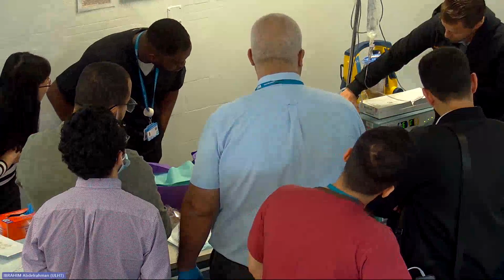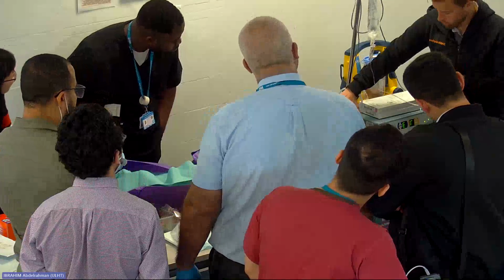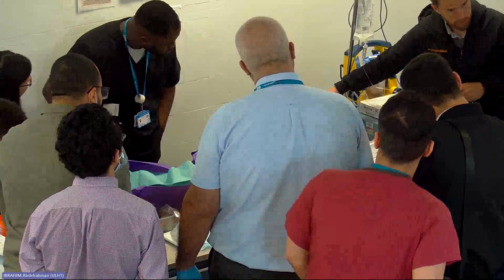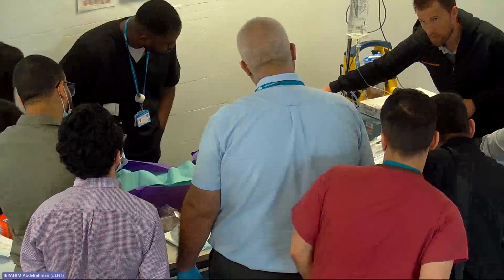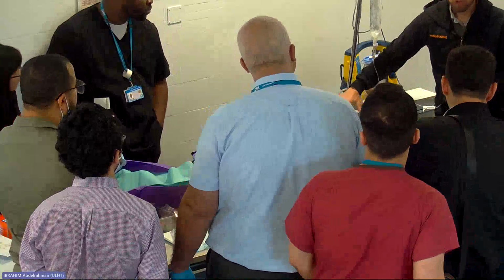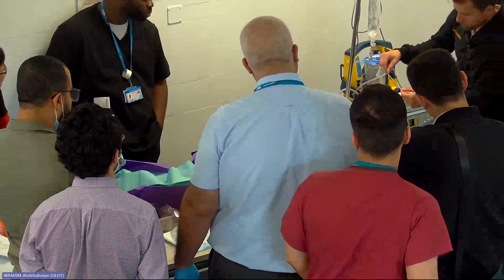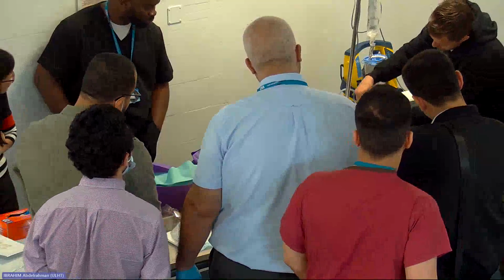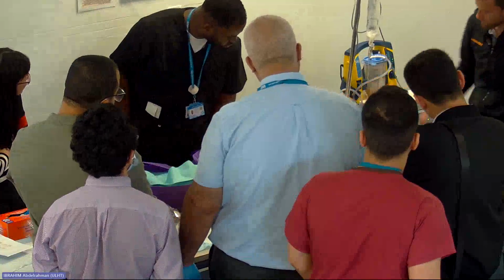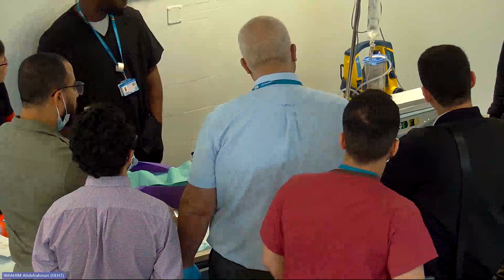So basically, this switch here is just a pinch valve that goes backwards and forwards. I turn it to the side, you can see how it just goes backwards and forwards there. See, backwards and forwards. So you want the light on, which means valve open, to be able to put the tubing in. What they'll do 9 times out of 10, they'll come along, they'll put it in like that, they'll put the switch down, they'll say, yeah, it's ready, it's good to go, and then saline will just carry on pouring.